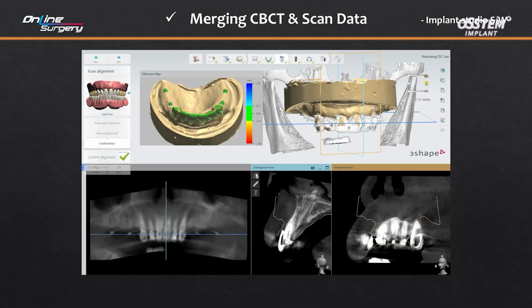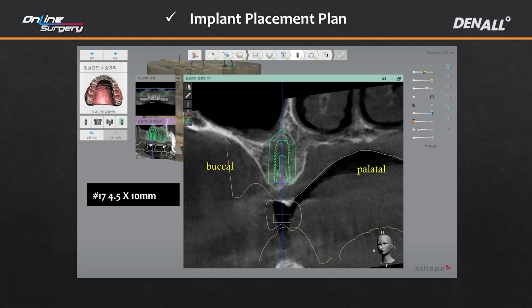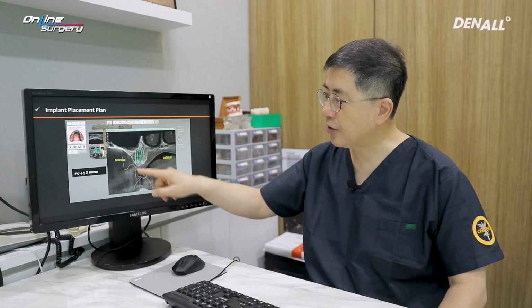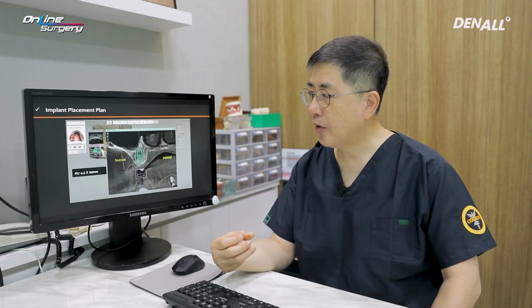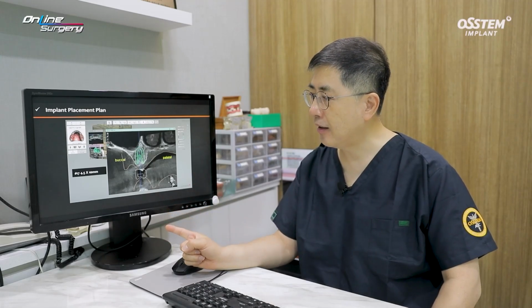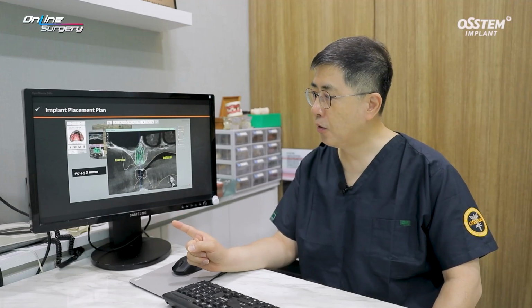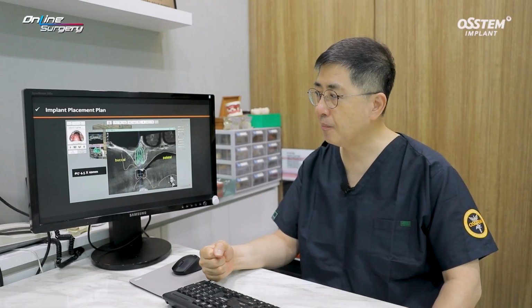Through merging via implant studio, an implant surgery plan was made. Implant placement position and angle was adjusted following the virtual prosthesis design. We chose the appropriate implant size following the bone quality. In number 17, 4.5 by 10 mm implant was planned, but the design was to use wide hole design. In the case of OneGuide, there's a wide hole to place a 5.0 implant, and you need to use regular hole in order to place 4.5 diameter implant. In this case, provisional needed to be connected, and if primary stability was insufficient while placing 4.5, I would need to resort to 5.0. Therefore, in light of the possibility that I would need to use a 5.0 diameter implant, I chose wide hole design.